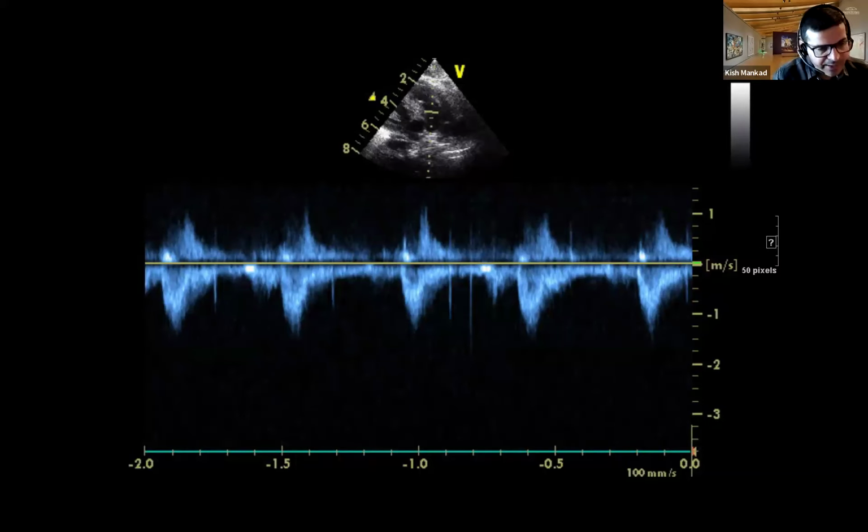Because with an ultrasound scan, not only can you assess the flow using Doppler, but you can also look at compressibility of the sagittal sinus and some of the other sinuses through the amazing acoustic window that you have with open fontanelles, as well as from the sides where you can interrogate the lateral venous sinuses. So really useful test. If you're stuck, please do recommend.